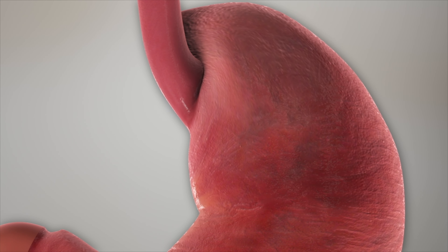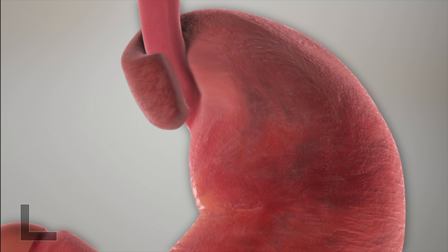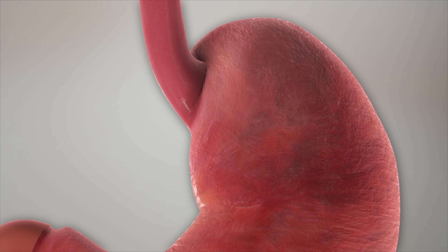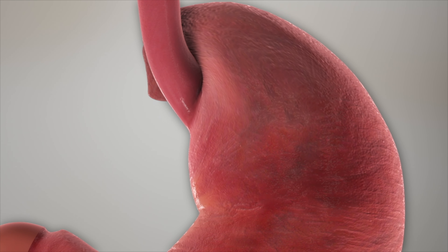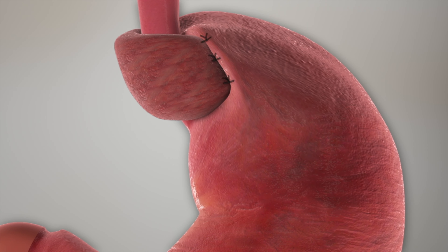The Toupet procedure, or 270-degree stomach wrap, essentially involves wrapping the top part of the stomach partially around the LES. This stomach wrap contrasts with the more standard Nissen fundoplication, or 360-degree stomach wrap, which goes all the way around the LES.